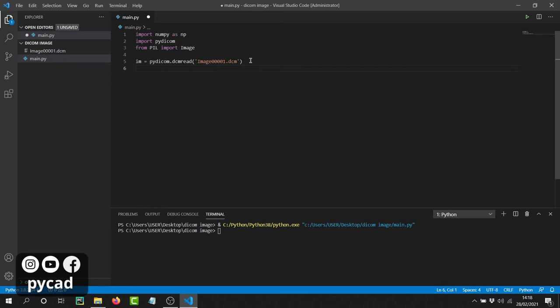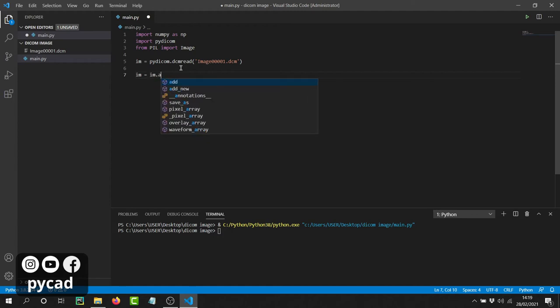Now, a DICOM image contains a lot of information — it contains the pixel data we want to display, and also patient information and much more. In this case, what we want to do is convert only the pixel part, only the image part. So we have to extract the array of pixel values, and this array is what we will use to create the JPEG or PNG image. I'll store it back in the same variable using `image.pixel_array`.